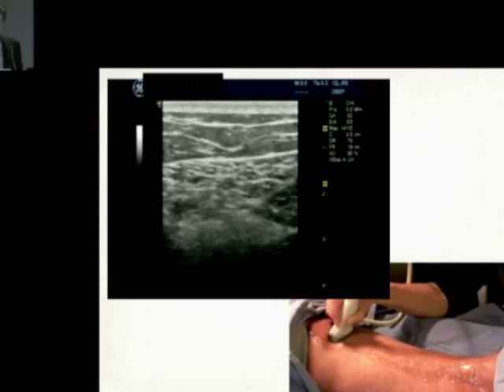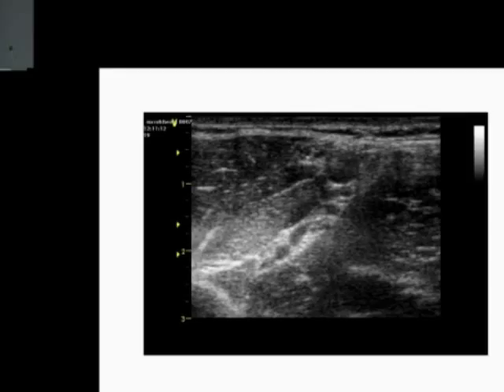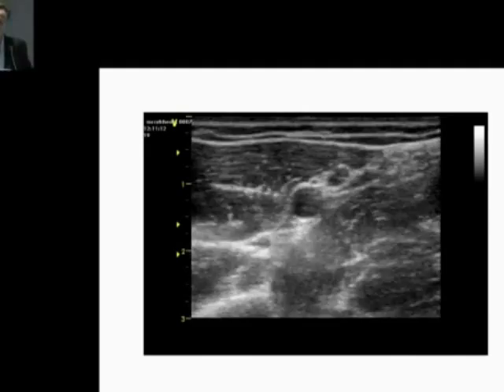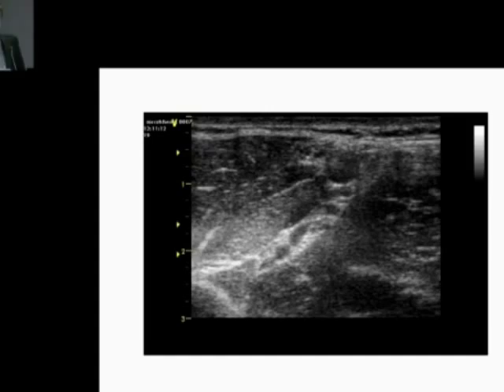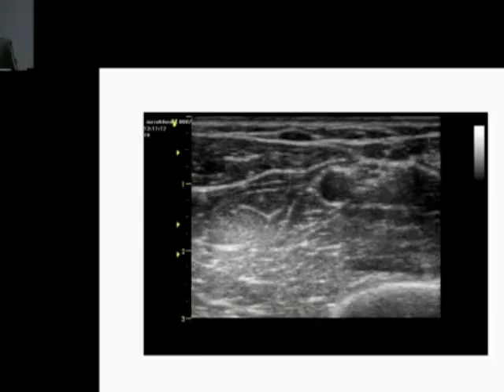Here is an example of dynamic scanning of the brachial plexus: scanning high in the humerus, we can identify the axillary artery and humerus. The radial nerve traces obliquely down to the posterior part of the humerus and therefore doesn't appear as a round structure. The median nerve stays right next to the artery all the way down the humerus. These structures have patterns that we can identify only through dynamic scanning, not through static scanning or placing the probe at one particular point.